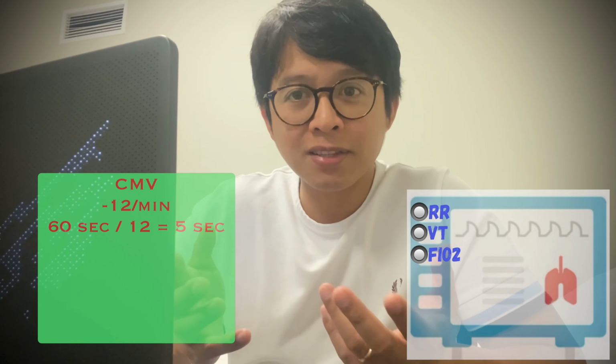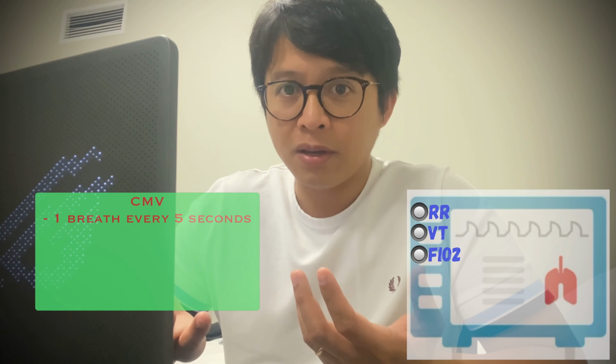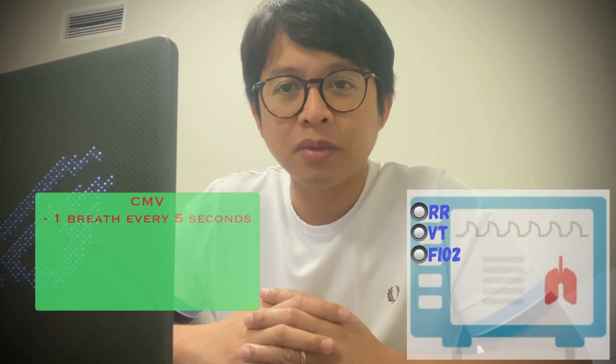So the vent gives a breath every 5 seconds. What if we set it to 20 per minute? The ventilator will compute 60 seconds divided by 20, which is equal to 3. Therefore, the vent will deliver a breath every 3 seconds.